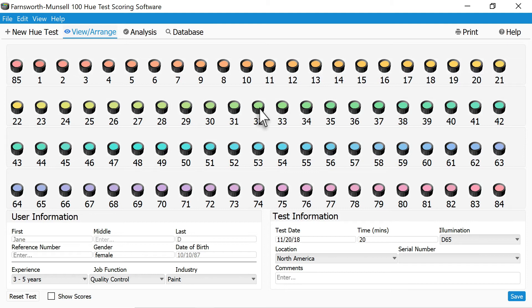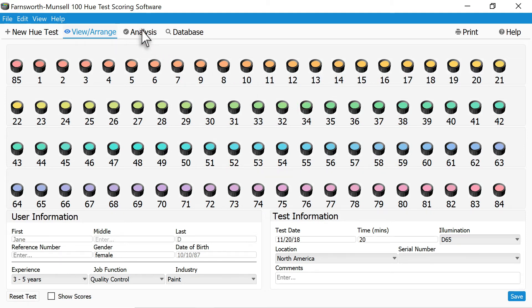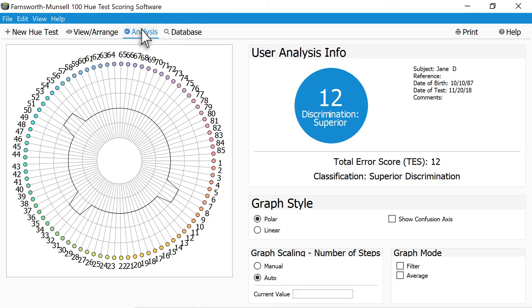Repeat this process for all the other trays. A final score will be displayed within the software, along with a chart indicating what colors the subjects had problems discerning.